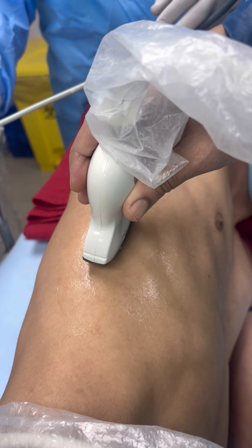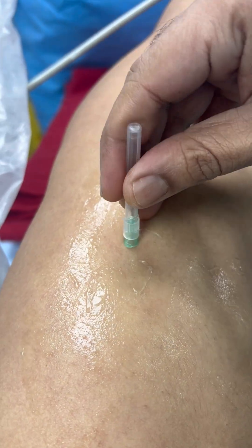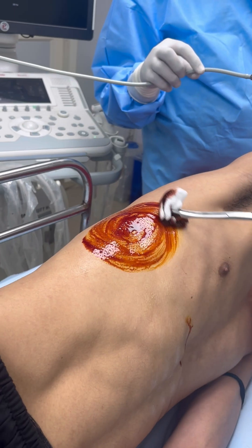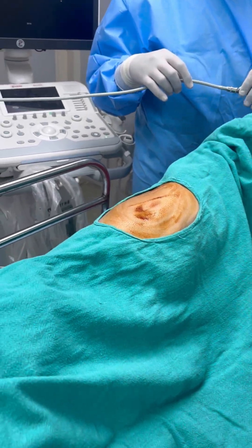This is a right-sided pleural effusion. First, we will screen with ultrasound. This is a multiple-loculation case. We will mark the site, then clean with spirit and betadine. After that, we will spread the draw sheet.